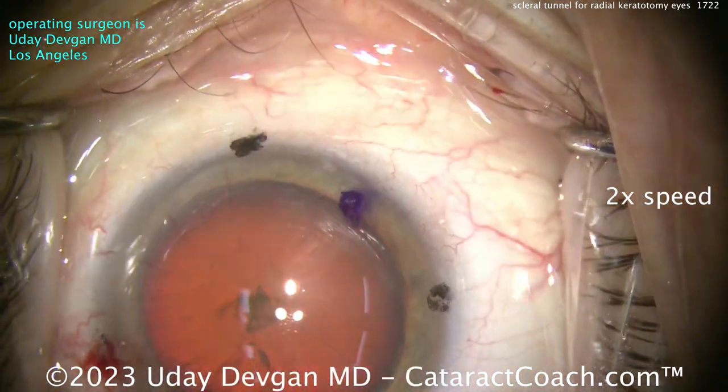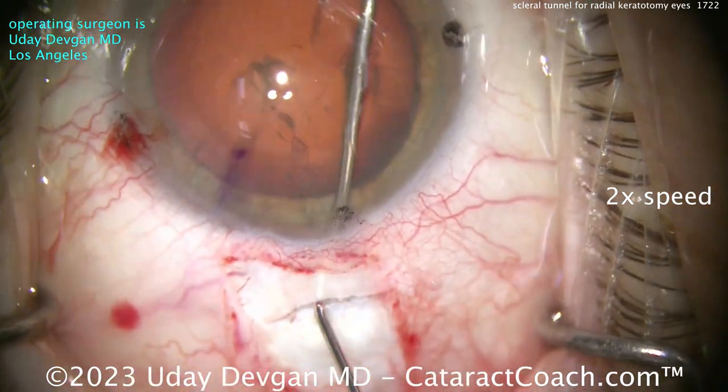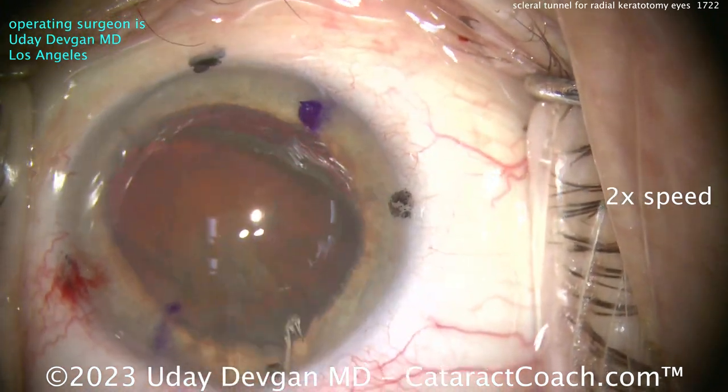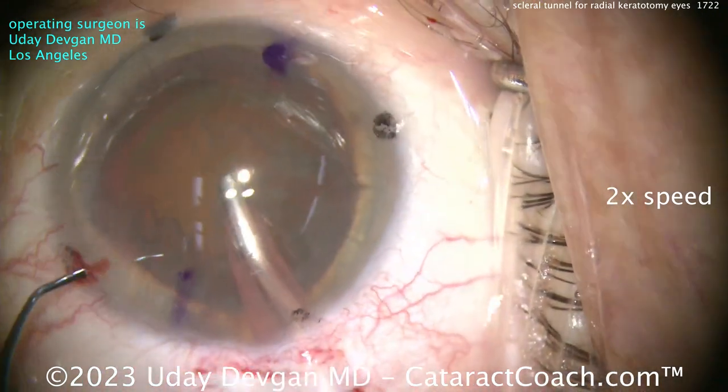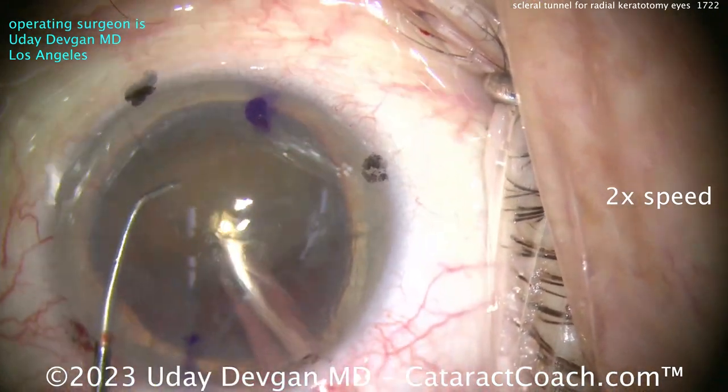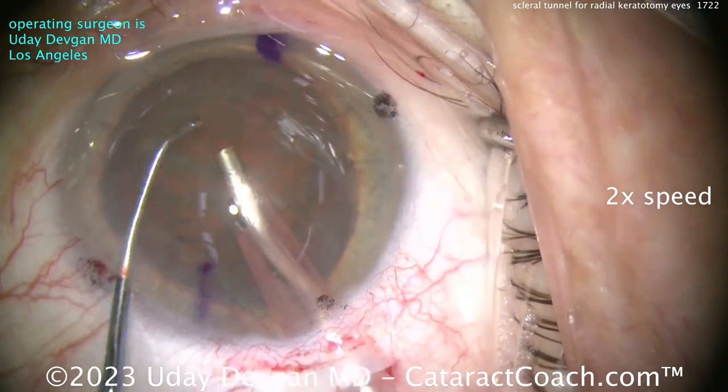The two purple ink marks indicate approximately the correct meridian where we're going to place the lens — it is going to be a toric lens. The black dots on the cornea are just the cardinal axes: 90 degrees and also 180.